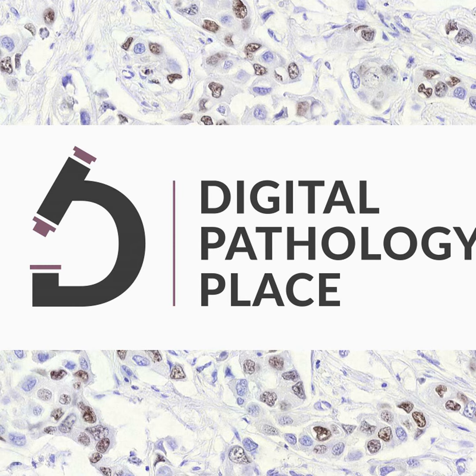Whole slide images for primary diagnosis. In a landmark move, the FDA approved whole slide imaging for primary diagnosis in surgical pathology in 2017, with the Philips IntelliSite system approved as a Class II medical device. This represented a significant endorsement of digital pathology by a major regulatory body. The FDA followed this by granting Leica Biosystems 510(k) clearance for the Aperio GT 450 DX system in 2019 and Hamamatsu Photonics for their NanoZoomer S360MD slide scanner in 2022.